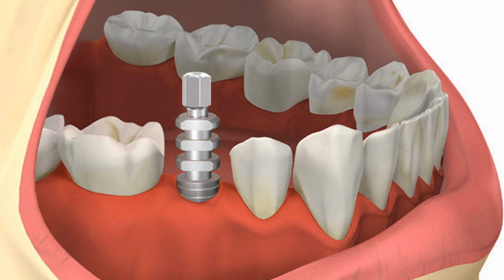If you have two implants side by side with two impression copings, I always like locking them together with some sort of rigid material. My material choice is composite resin. As you're going to see in the splinting section of this video, there are other materials out there as well.